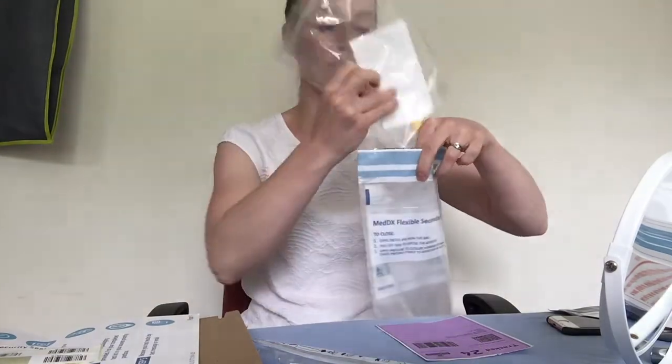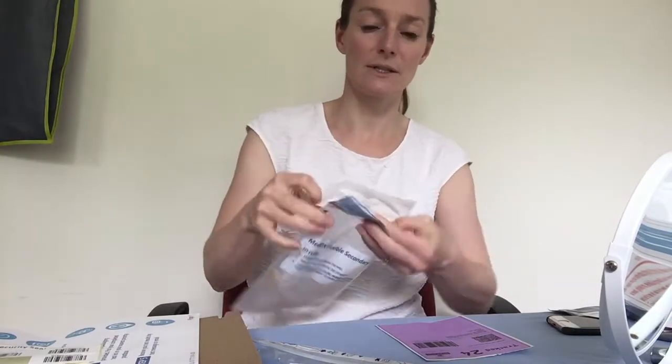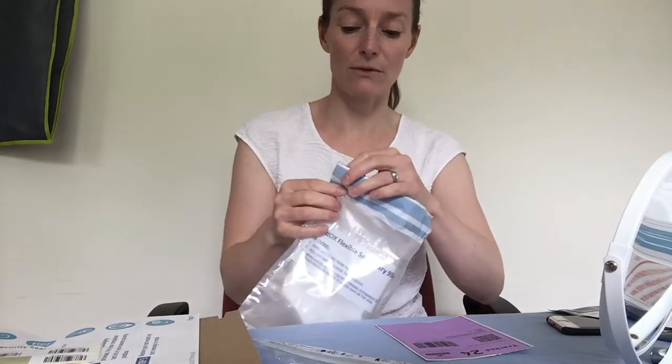Then you're going to use the silver seal to seal that bag. The silver seal is here — you peel off the silver seal and then you stick it together.